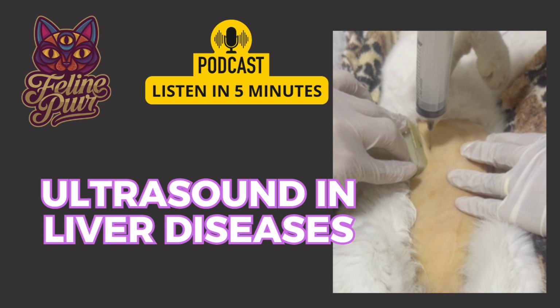Visualization of the bile duct is easier in cats than in dogs. In a sagittal section, the bile duct can be found ventrally to the portal vein. The normal diameter of the bile duct in cats is up to 4 millimeters, measured intraluminally. Ultrasonography allows the identification of dilations, thickenings, and obstructions of the bile duct, and the use of color Doppler is crucial in these cases to differentiate the bile duct from blood vessels.